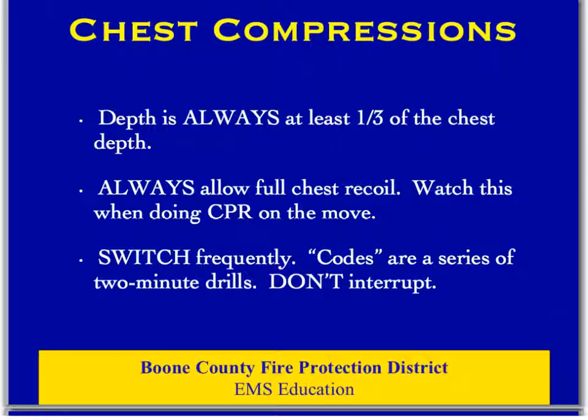And we should also switch frequently. Your first minute or two of compressions are your best minute or two. And it is not an ego thing. It's simply a matter of switching fresh people in. So as soon as we have adequate people to do that, we should position one on each side of the chest. And after every 2-minute cycle where there's a pulse check and a rhythm check by the AED, then we're going to switch compressors. We want to limit our interruptions in CPR.